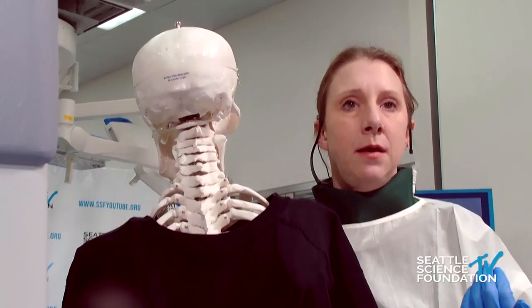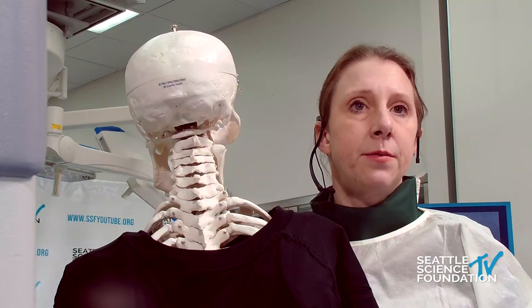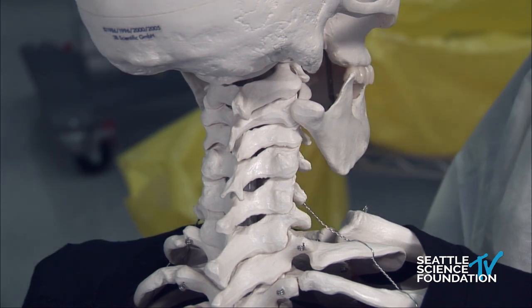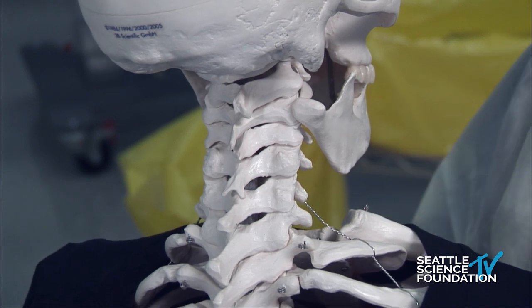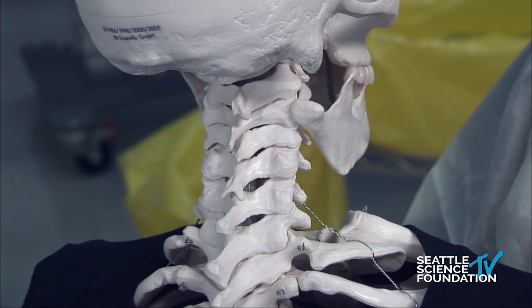I will go back to AP, and I will confirm that in an AP view my needle is really hugging or lying closely against the lateral mass. I already know that because I feel the needle moving along that surface, but the AP view, we always want two views in any procedure that we're doing, to allow a breadth of perspective for safety and confirmation of what we believe we see. In that AP view, confirming the position against the side of the lateral mass, then I will start to do testing for the patient.